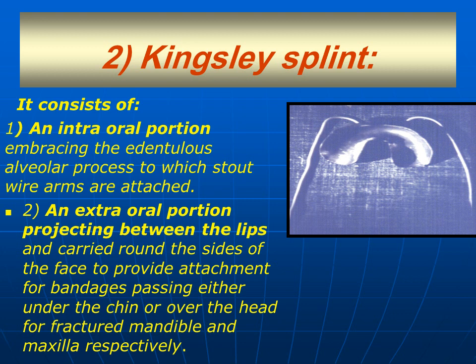and then I have to connect to this stent an extra oral portion projecting between the lips and carried around the sides of the face to provide attachment for the bandage, passing either under the chin for the fractured mandible or over the head for the maxilla.